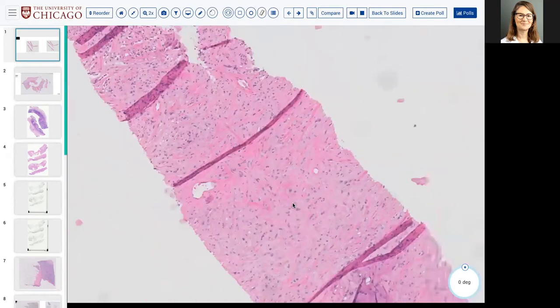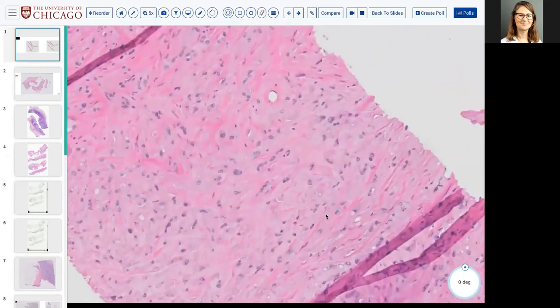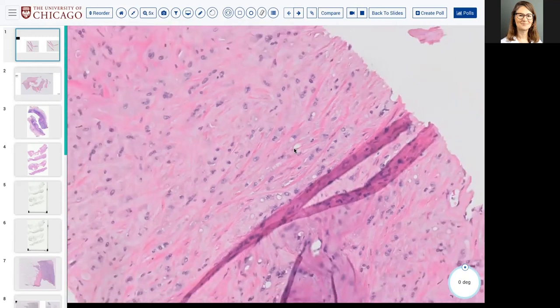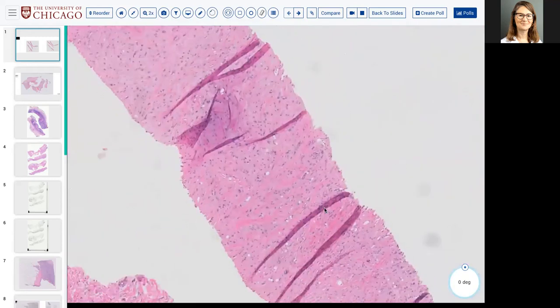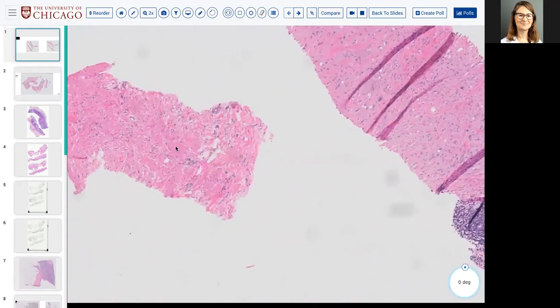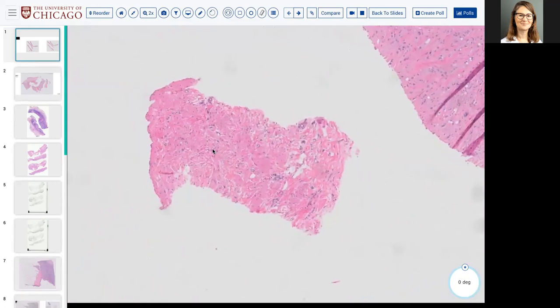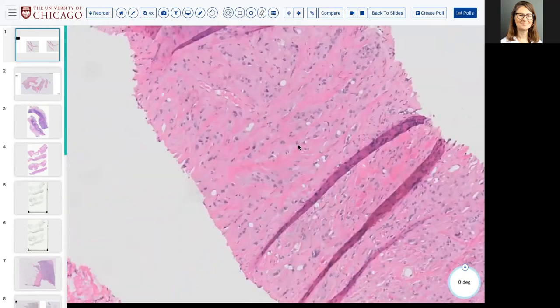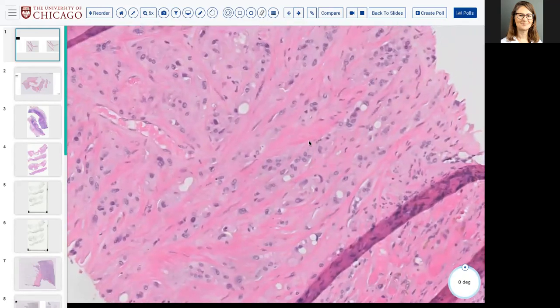Specifically, hemangioendotheliomas of the epithelioid variant can have some nice blister cells and can be multifocal. It is uncertain whether that multifocality in the body means that they are metastatic or multiple primaries. They can arise in visceral organs, in bone, and in soft tissue. So they're very, I don't want to say promiscuous, but they really kind of are.